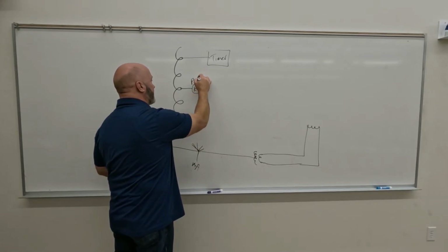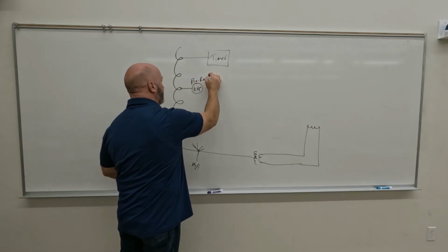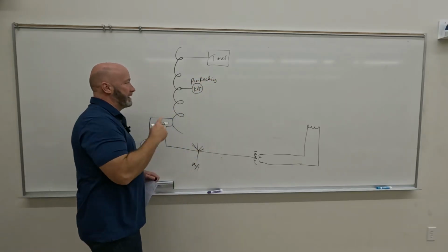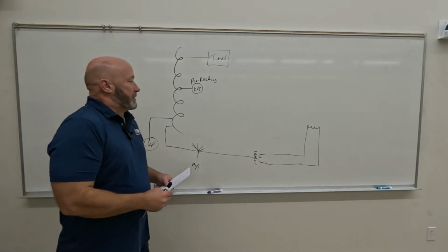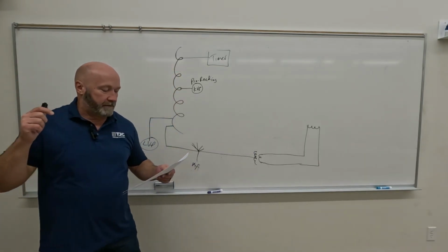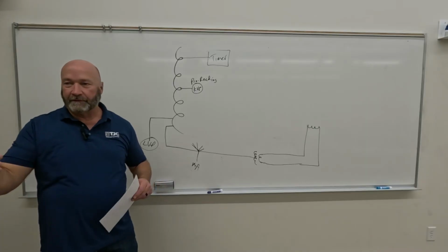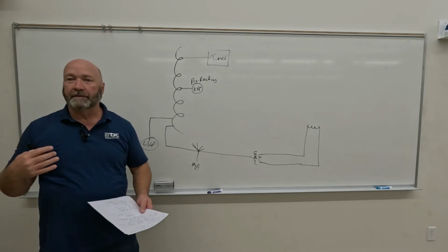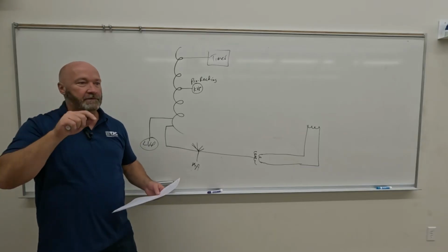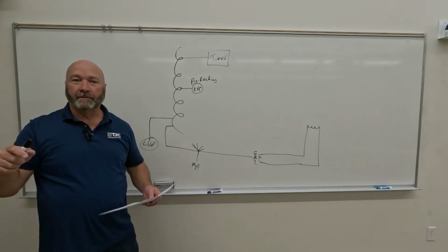It's pre-reading because you don't have kVp yet. We haven't gone through the high voltage transformer, right? So when it receives that proper amount of radiation, it'll send a signal over the timer circuit to discontinue the timer.